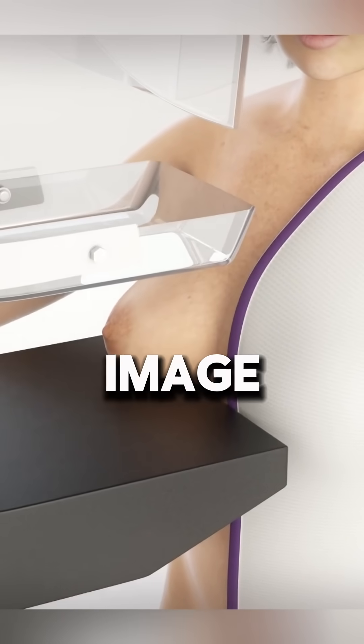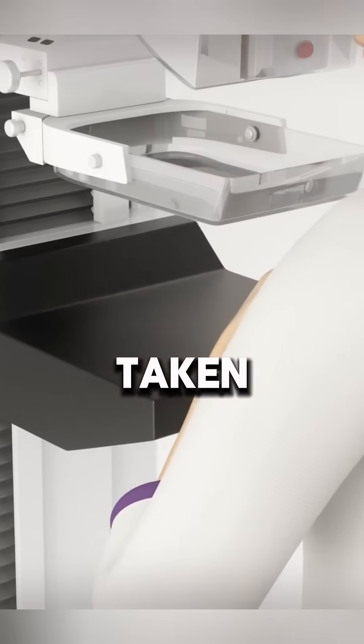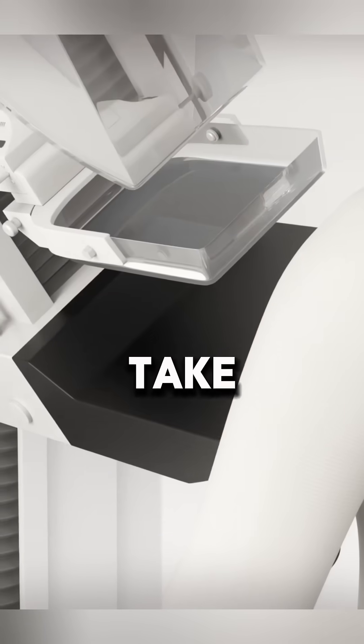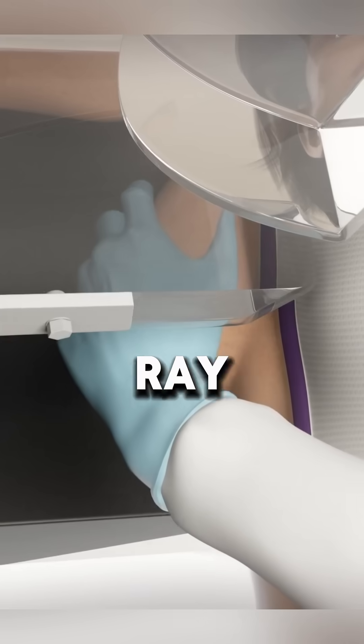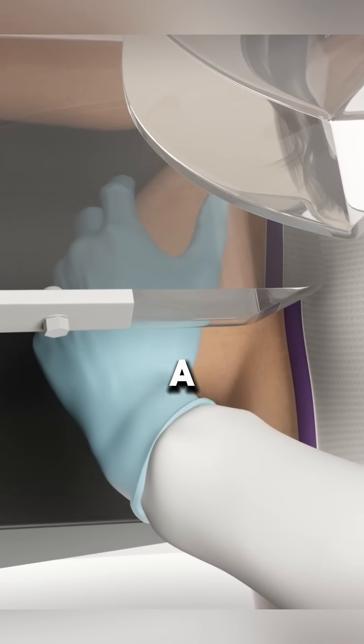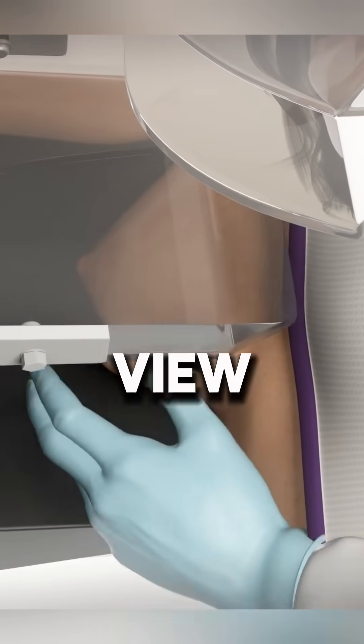After the first image is taken, the machine is repositioned to take another x-ray from a different angle to get a more complete view.